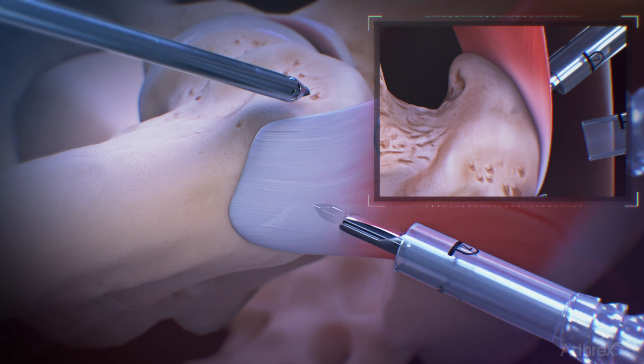Insert the drill guide and obturator through the posterior lateral cannula and then directly through the gluteus medius tendon and down to bone. While keeping the drill guide tip firmly against the bone, remove the obturator from the guide and insert the drill bit.